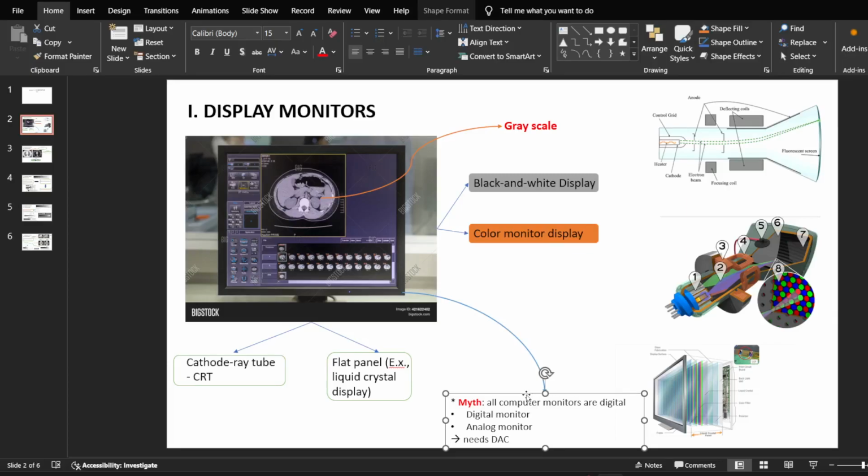What is DAC? It is an abbreviation of the full words digital analog converter. And that's it. But this kind of aspect is too technical, so I don't think you need to understand or remember it. So, my friend, let's have some conclusion about this slide.